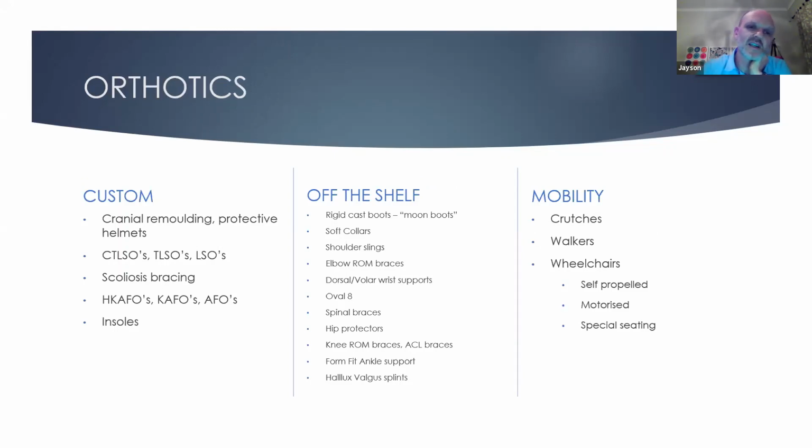These, as the market has grown, can be off the shelf as things have been standardized and costs have become a huge factor. Or in many cases where there's weight concerns or you've got long-term wearing of a device or you need complete immobilization or specialization, then we customize the devices.